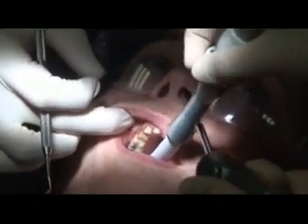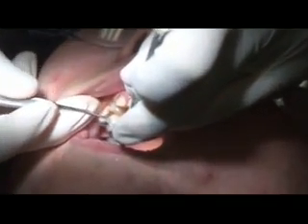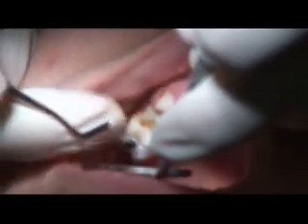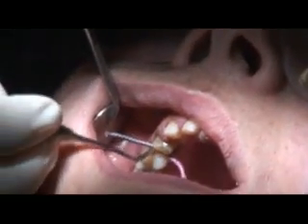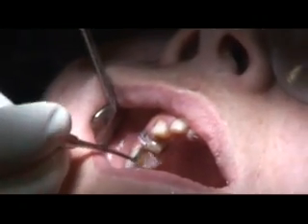Remember, just because one step follows the next doesn't mean that we just go to it. We make sure that we have completed what we're trying to complete with each step. So now I have a better view. I can see a couple little spots where I haven't packed it below the margin. Now that looks great. Okay, there's no bleeding sulcus, so that's good for me to now put another layer of Viscostat. If you can always remember what our ultimate purpose is: to be able to have an exposed margin, no bleeding, when we take the cord out for an impression.